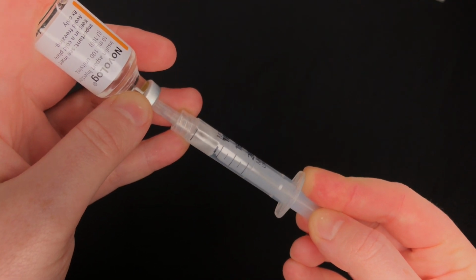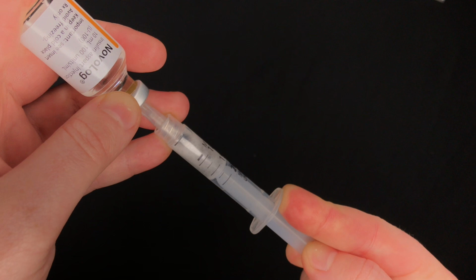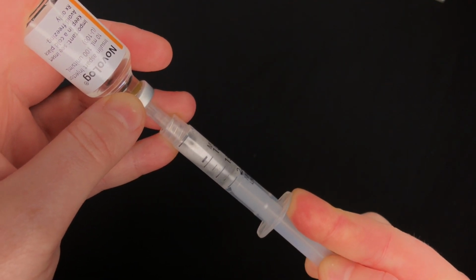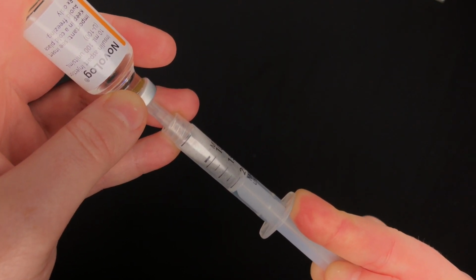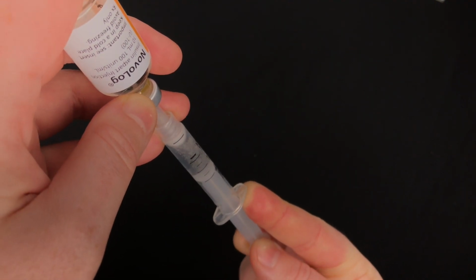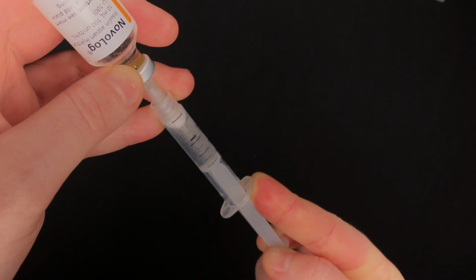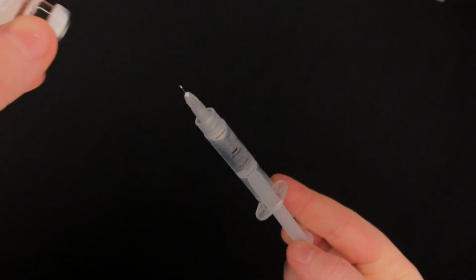Now in order to activate the Omnipod, you do have to have a minimum of 100 units in the pod. It can take a maximum of 200 units. So keep in mind, if you do go through more than 200 units within a 3-day period, you are going to have to change your pump sooner, because you cannot refill your pod while it's on.